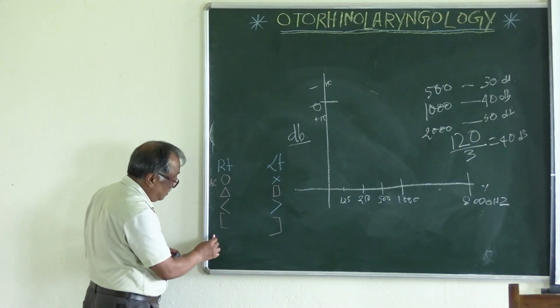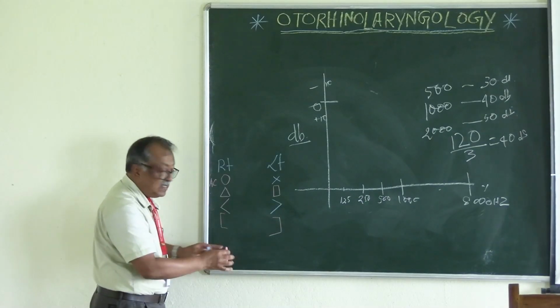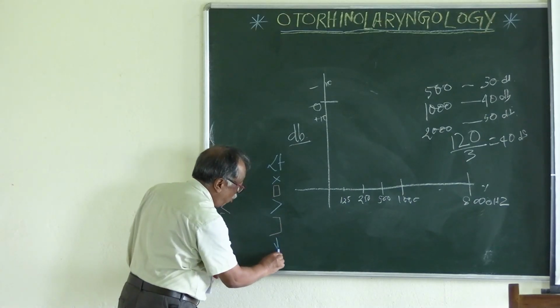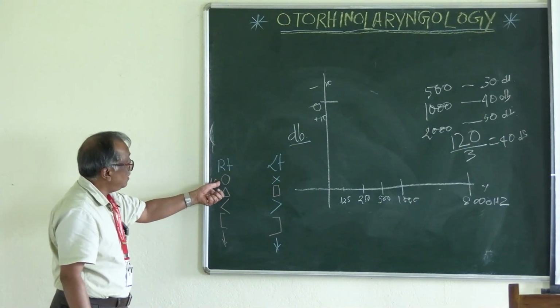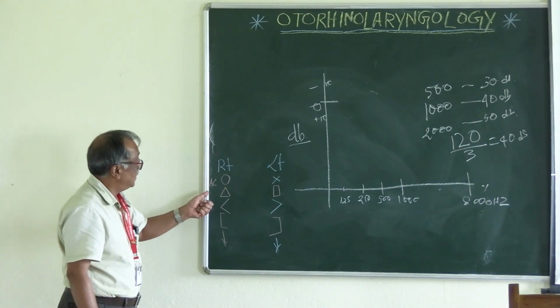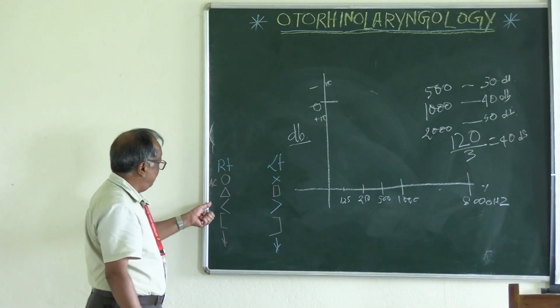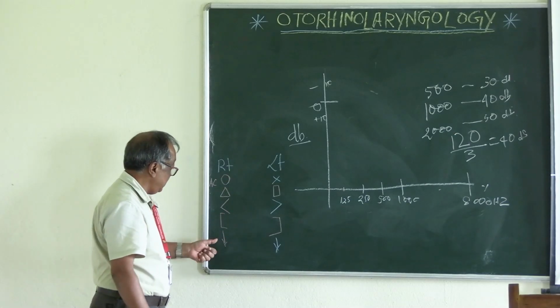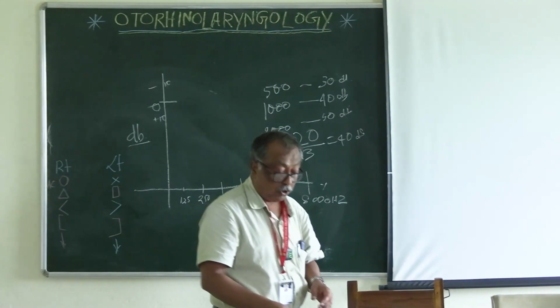And when it is profoundly deaf, you cannot assess the hearing, you just indicate in such a way. This is the drop. That means the AC normally without masking, AC with masking, BC without masking, BC with masking, and it's the profound deaf. This is the sign for the audiometrician.